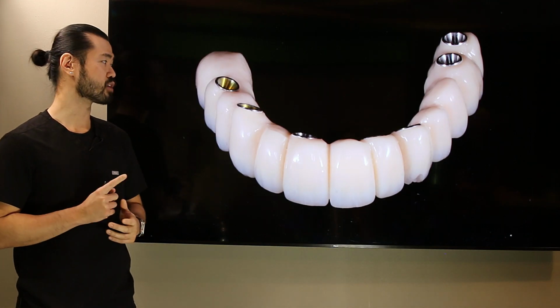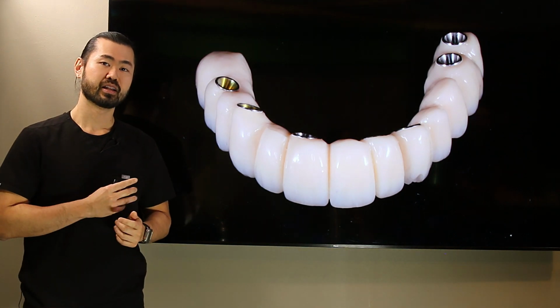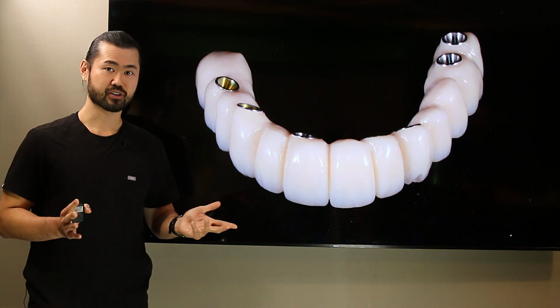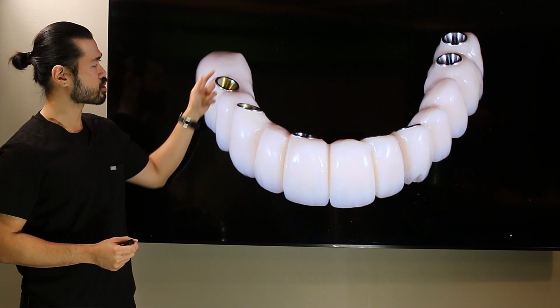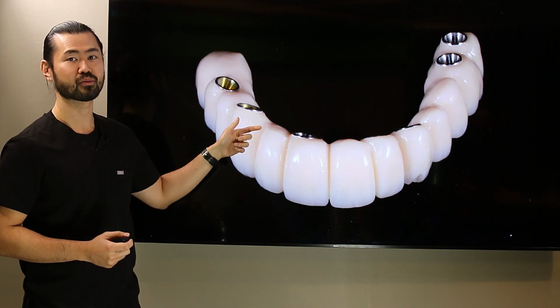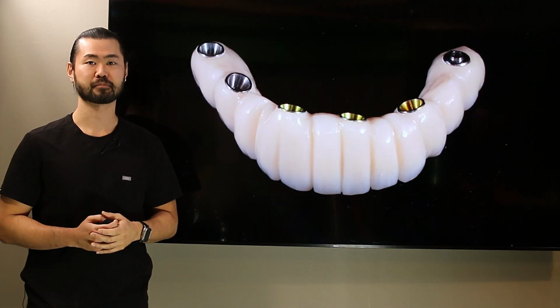Now, we also pay a lot of attention to the underside of the prosthesis. This is where it gets really important. This is an area that not a lot of people ever see, and you don't see it when you're opening your mouth. But we want to make sure that the contours here are very nice and convex and round so that it's very easily cleaned and something that you can maintain for a long time.